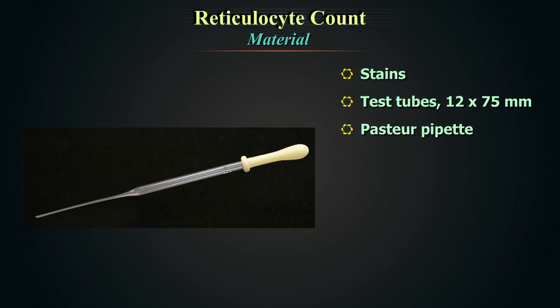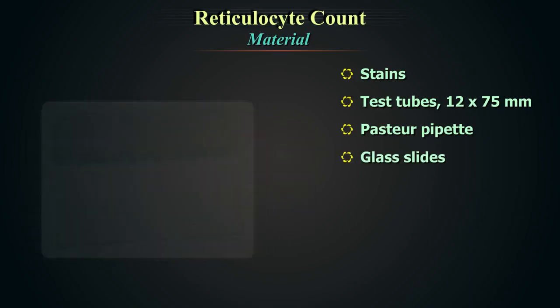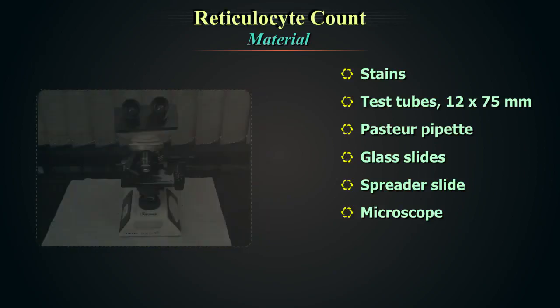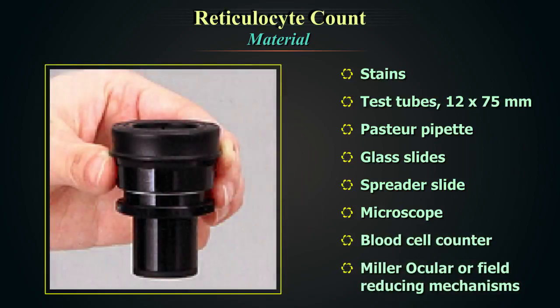Pasteur pipettes, glass slides, spreader slide, microscope, blood cell counter, Miller's ocular or field reducing mechanisms.